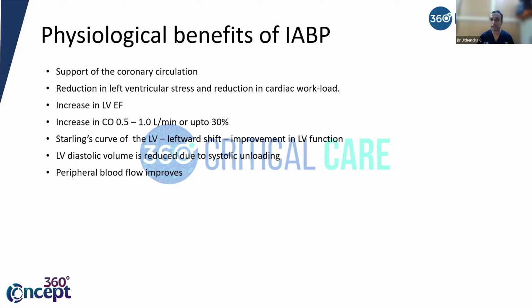So there is a reduction in LV stress and a reduction in LV afterload after deflation at systole. There is a sudden giveaway, so that will facilitate the LV. The workload suddenly comes down. That will facilitate the heart to work, mainly the LV. So there is an increase in LV ejection fraction because the afterload comes down. The LV ejection fraction becomes better.